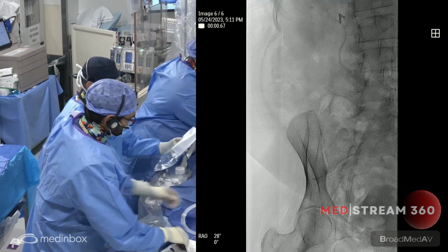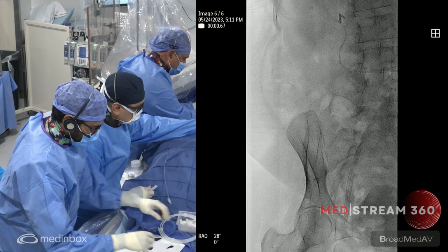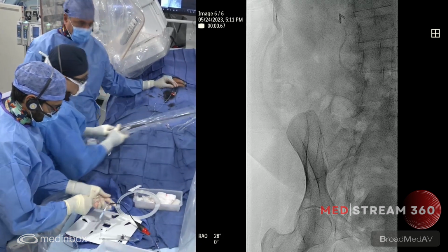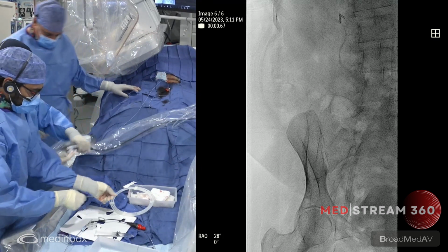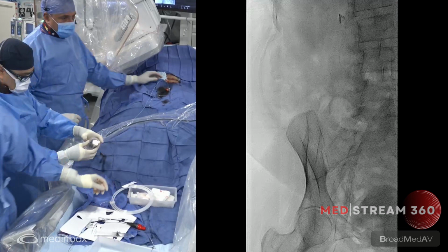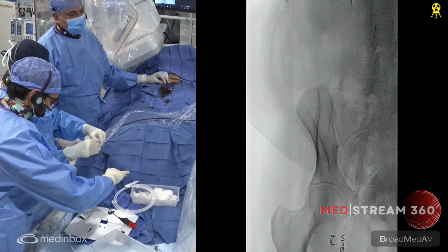As far as the system that we've got right now, we've got a 7 French up and over system. Doesn't have to be a 7 French. We always do a 7 French because we do a lot of live cases. And with live cases, you need to have the ability to switch equipment or whatever it is as much as you possibly can. So now we're going forward.